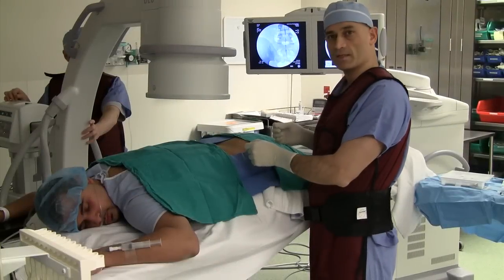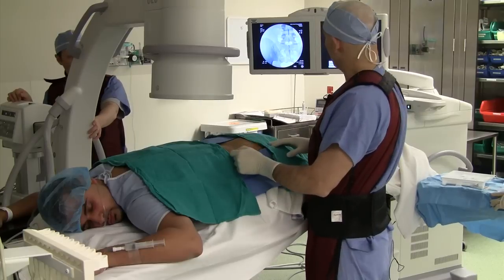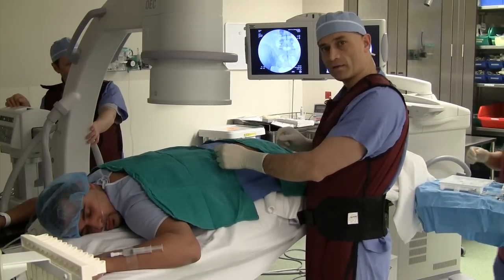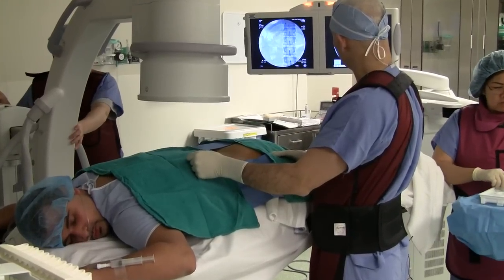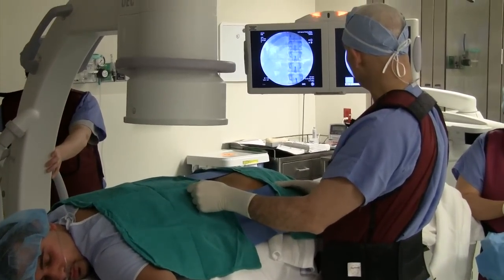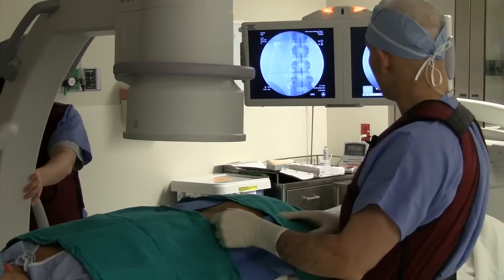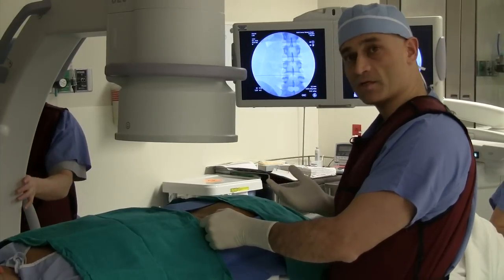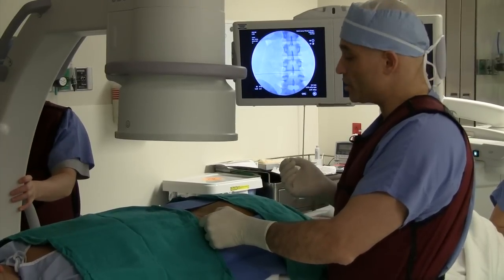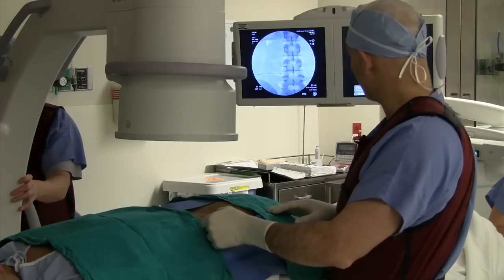The procedure is commenced with the identification of the lumbar intervertebral levels. And we start by identifying the level of T12. This is T12, L1, L2, L3, L4, and this is the L4-5 interspace. And today we're going to be injecting medicine into the patient's L4-5 neuroforaminal space on the left-hand side.